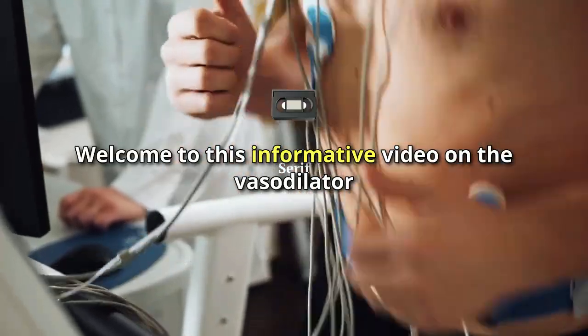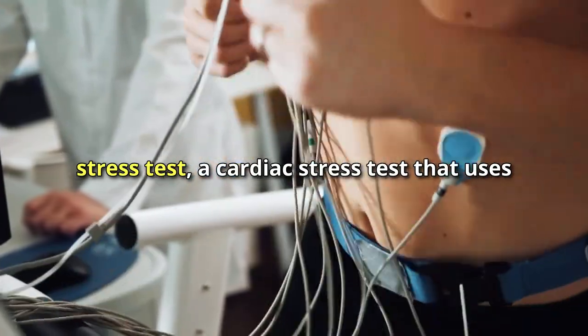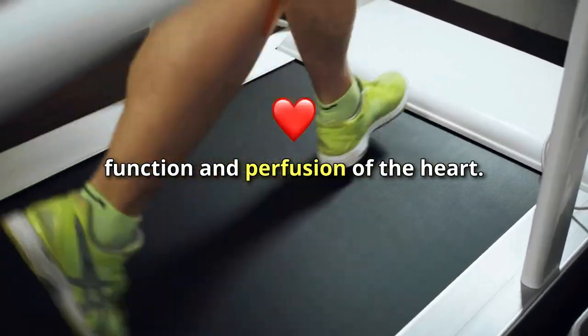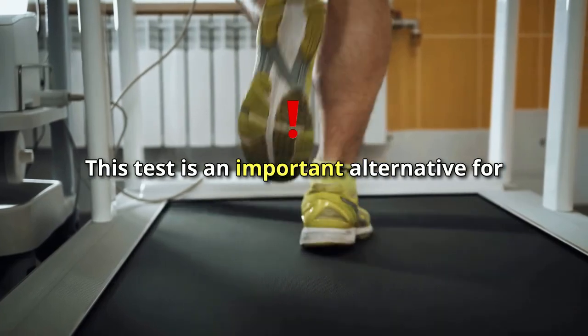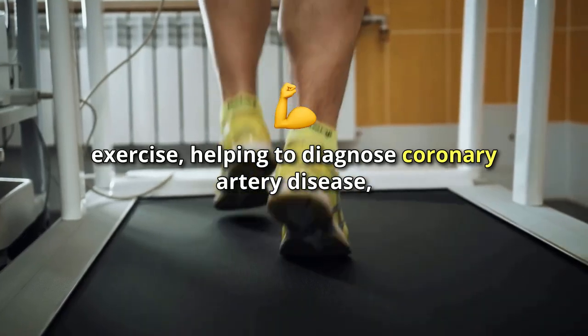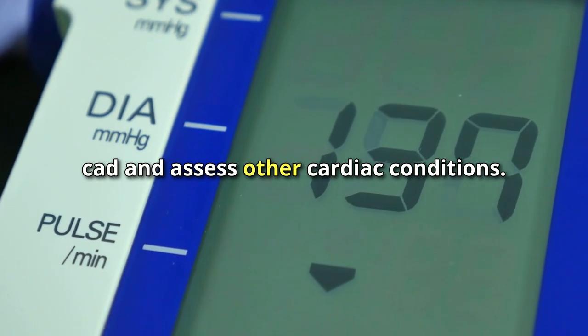Welcome to this informative video on the Vasodilator stress test, a cardiac stress test that uses agents like dipyridamole or adenosine to evaluate the function and perfusion of the heart. This test is an important alternative for patients who are unable to perform physical exercise, helping to diagnose coronary artery disease, CAD, and assess other cardiac conditions.